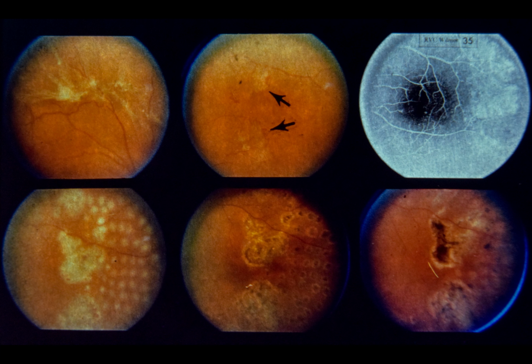Comment: epiretinal membrane formation and fibrous proliferation accompanying new vessels precludes focal photocoagulation treatment, as in this patient's right eye. Some eyes with fibrous proliferation may benefit from scatter photocoagulation treatment in an effort to reduce the vascular component of the proliferative retinopathy. This patient's left eye had neovascularization not accompanied by significant fibrous tissue, and the new vessels were closed with focal argon laser photocoagulation. New vessels have not reappeared 2.5 years following treatment.